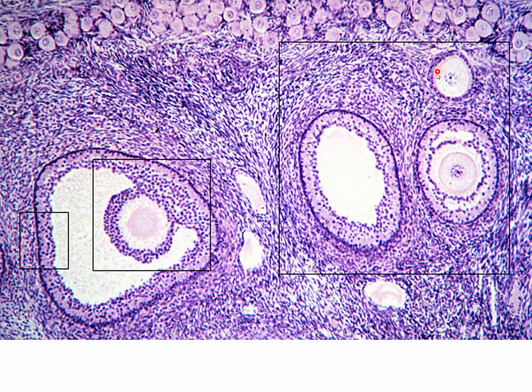I can't tell if we have one or two at this magnification. If that is a single layer of follicular cells, then that's still a primary unilaminar follicle. This is likely going to be a secondary follicle, maybe even a Graafian follicle. We just don't see the oocyte in this plane of section, which also might mean that we're looking at an atretic follicle. I don't really see the pyknotic nuclei. We just don't have enough information here to really help us out a lot.